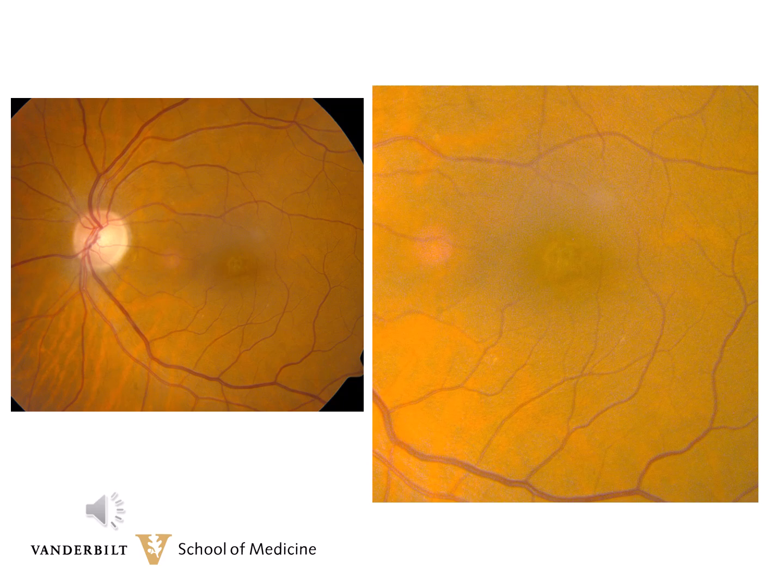This is a 64-year-old female, vision of 20/20 in the right eye and 20/60 in the left eye. The 20/60 vision in the left eye is secondary to a long-standing macular hole. Clinically, you can see some irregular foveal changes in the right eye. Clinically and on the vision chart, her vision has been stable for 4 years.